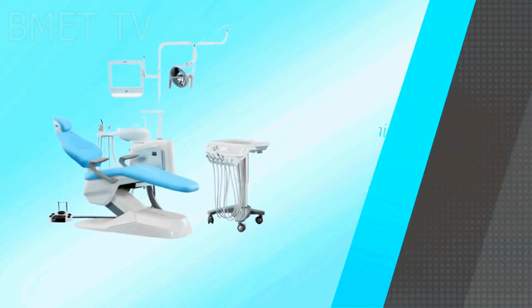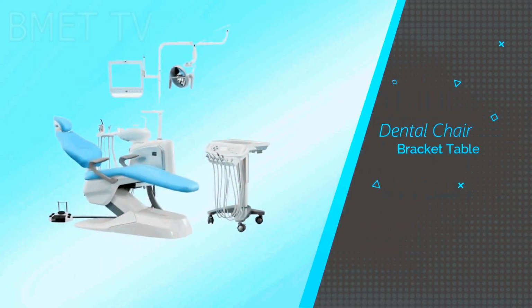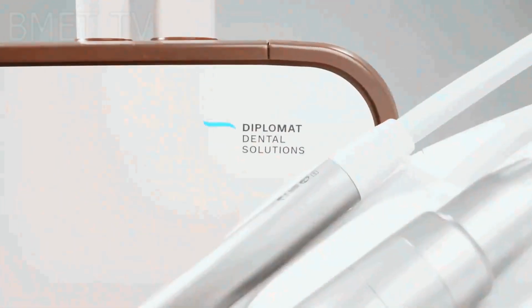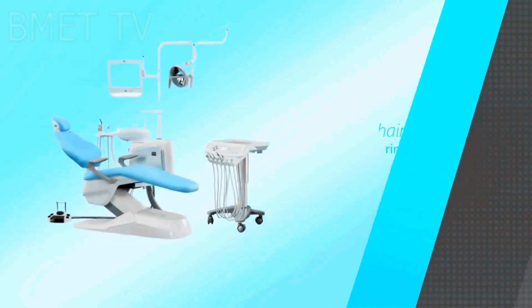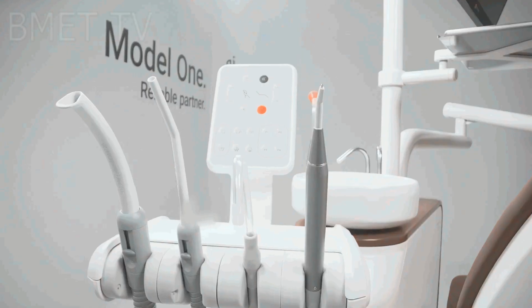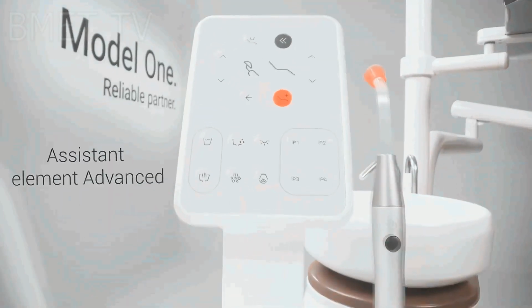The fourth component is bracket table. Bracket tables are used to hold hand instruments and materials such as cotton holders, cement mixtures, and diagnostic instruments, among many others. The fifth component is air water syringe. The air water syringe is one of the only dental devices that are used on every patient for every procedure. The 2 basic functions for this device are irrigating and drying.